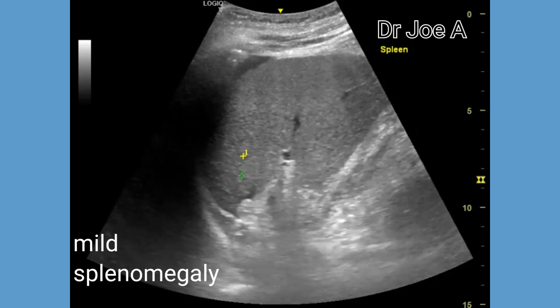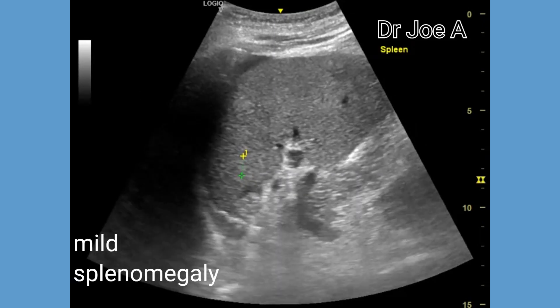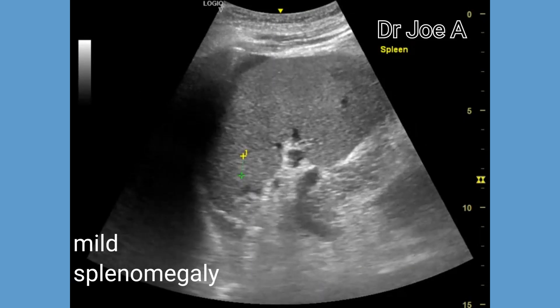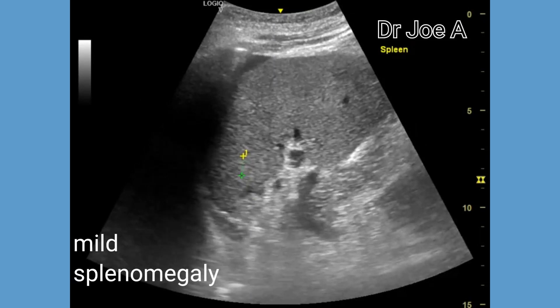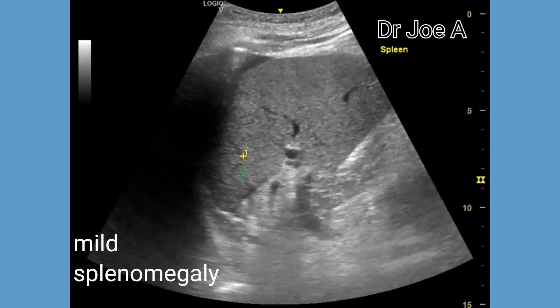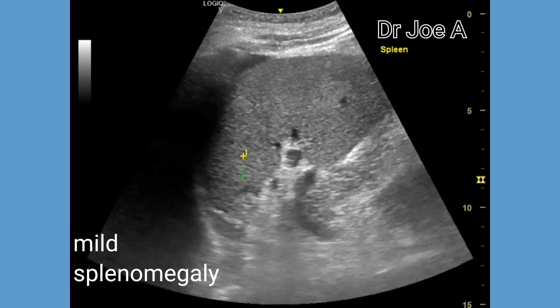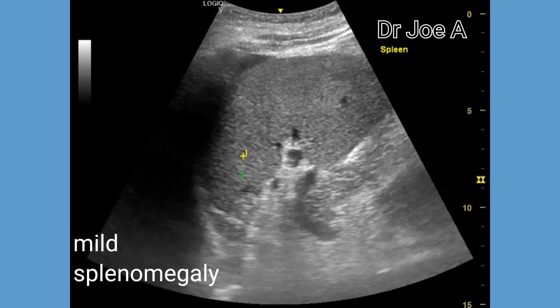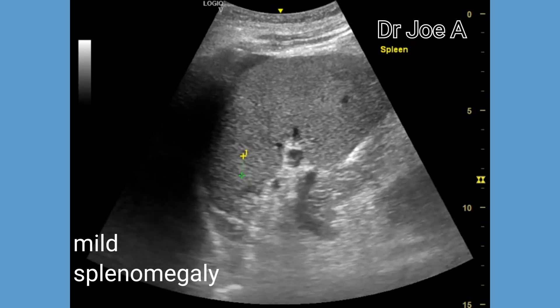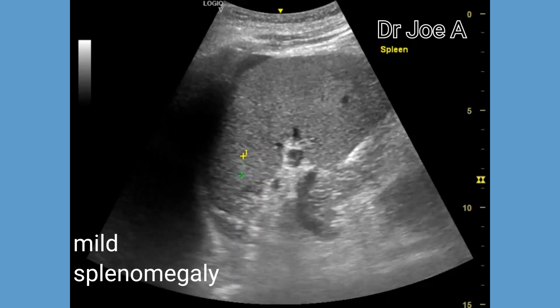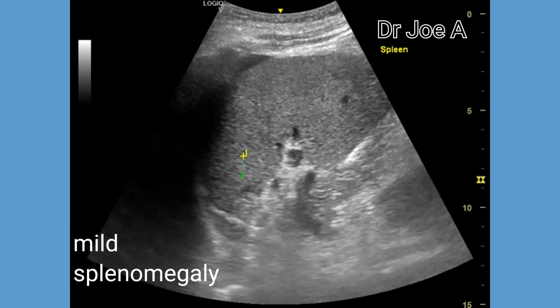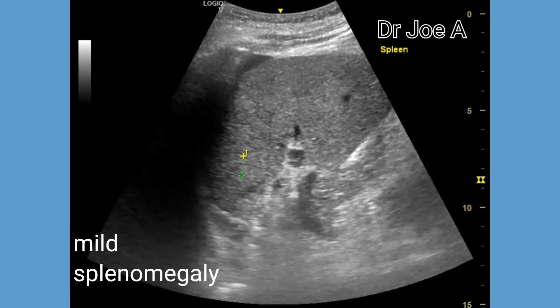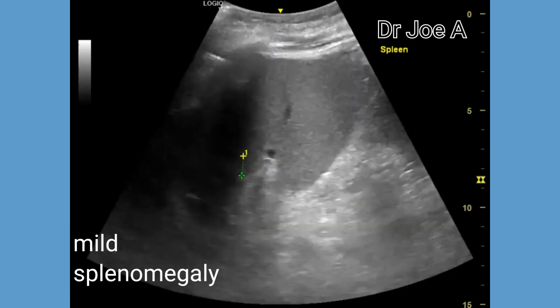Next we go to the spleen, which appears mildly enlarged. Thus we have two findings: ascites and mild splenomegaly.